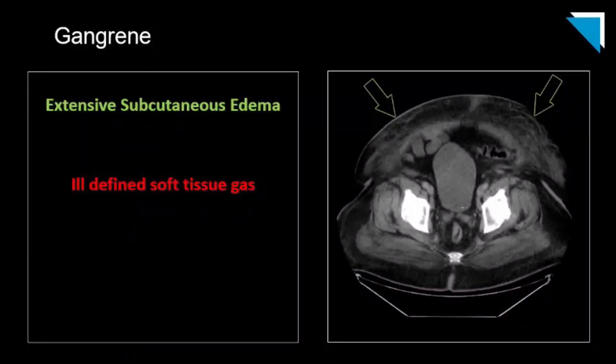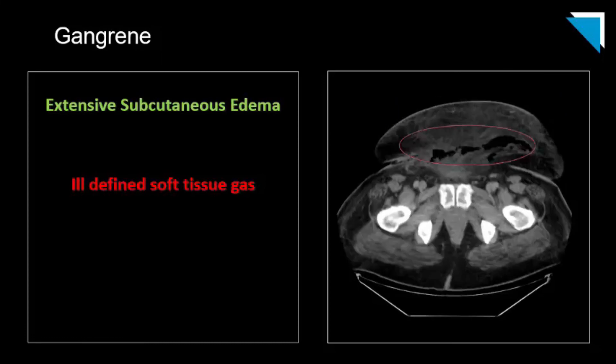On this contrast-enhanced CT scan, we see extensive soft tissue and skin thickening with subcutaneous edema in the ventral abdomen. More caudally, we see ill-defined gas in the subcutaneous soft tissues, compatible with gas gangrene. Here the perineum was not involved — just a reminder that gas gangrene can happen anywhere.